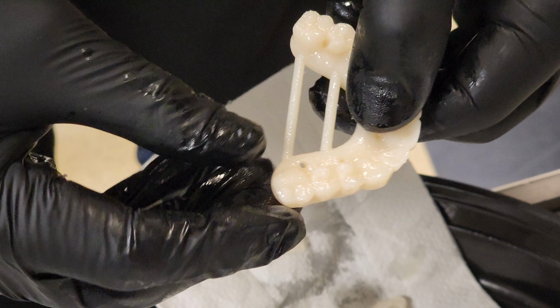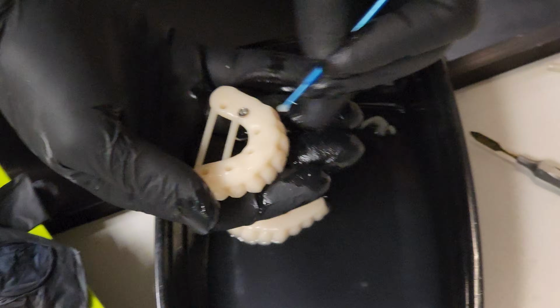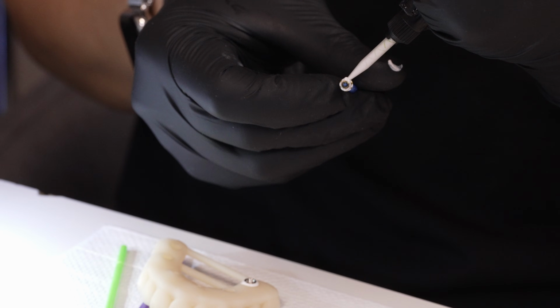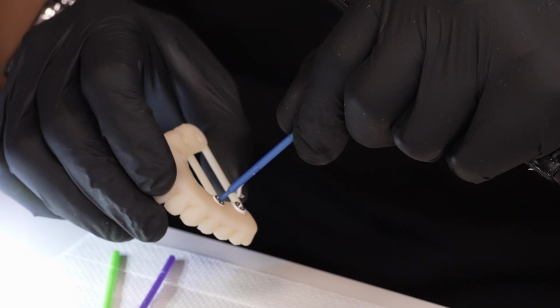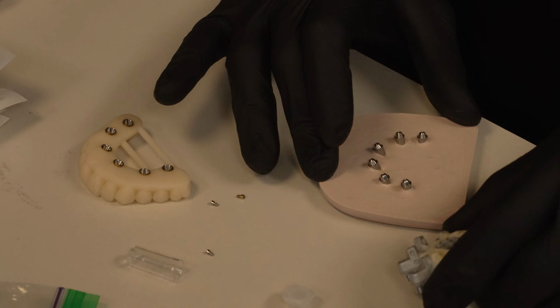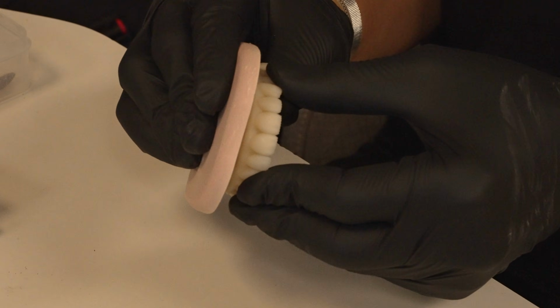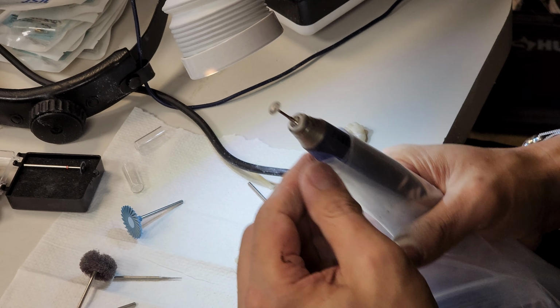And with all that printed out and done, we now add the metal housings into the implant dentures that will engage with the MU abutments. So each of these is going to connect with the MU abutments. And with those in place, before proceeding, we verify the fit with the analog implants that we have set in stone. And ours fits passively, which is a good thing. So now that we verified, we cement the MU abutment housings into those sockets that we made.